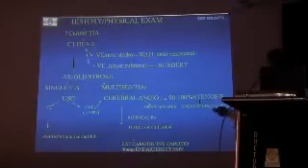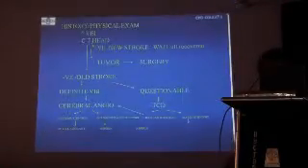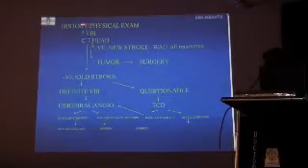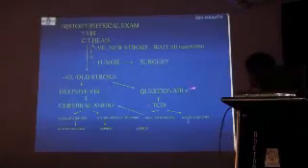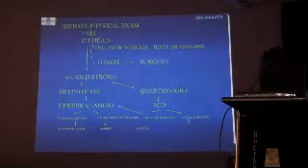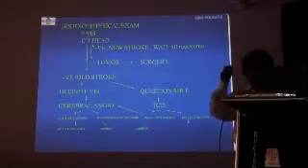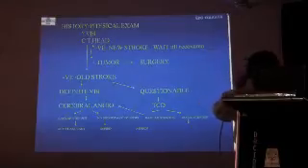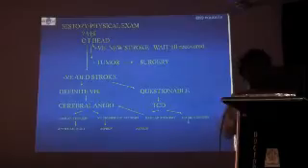So if you consider carotid TIA, then these are the things we have found. If you think of arterial insufficiency, then these are the things we have. Transcranial Doppler is one of the important investigations used in certain centers, and it gives a non-invasive assessment of the intracranial vessels.